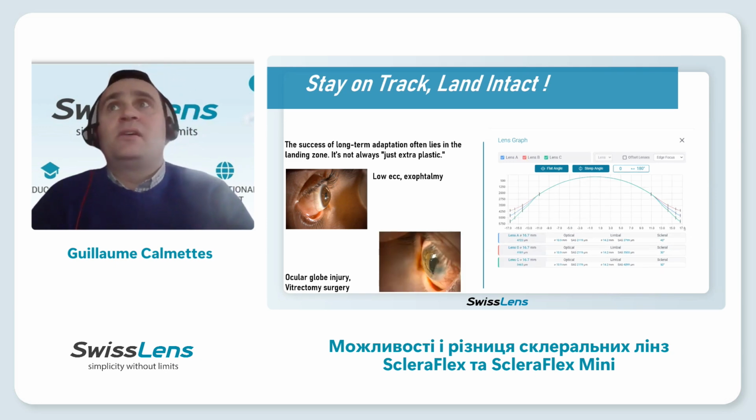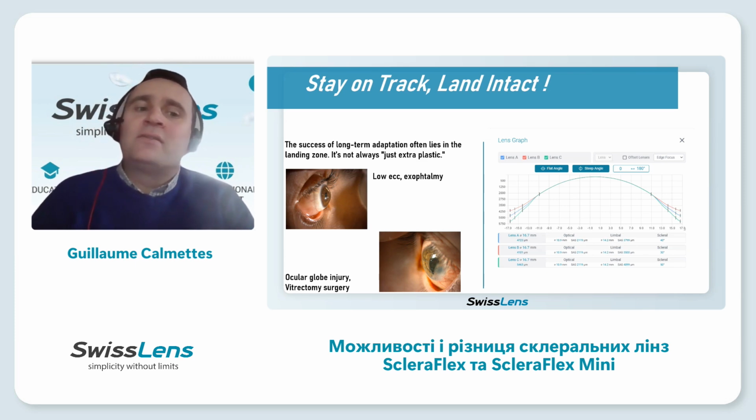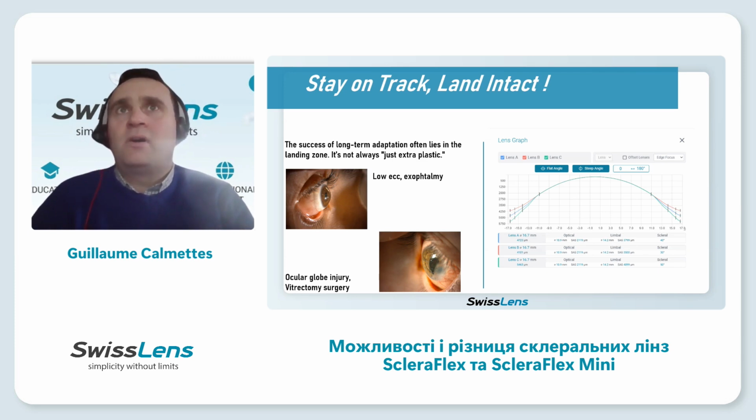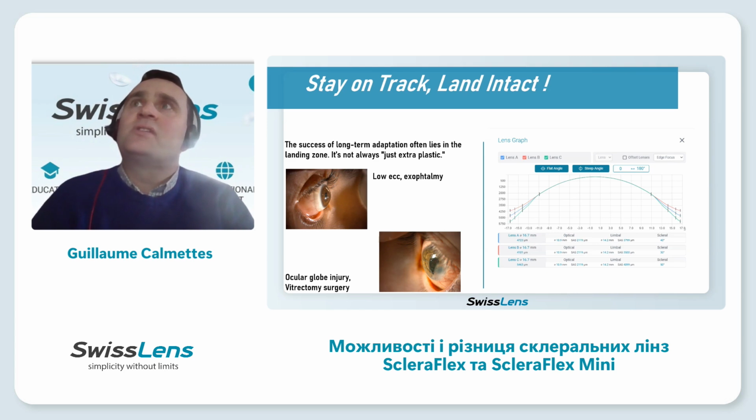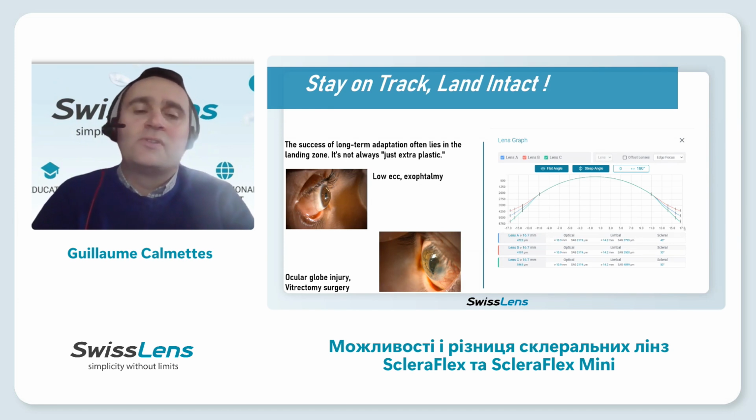The reverse is also something. You see, after some ocular globe injury or vitrectomy surgery, we can see some very, very flat eye and very, very flat cornea and sclera part. And with the online simulation, and the option you have for ScleraFlex, it's very interesting to see that you can show, so it's a red curve on the right part of the screen.